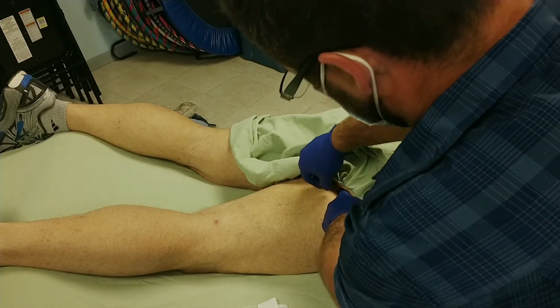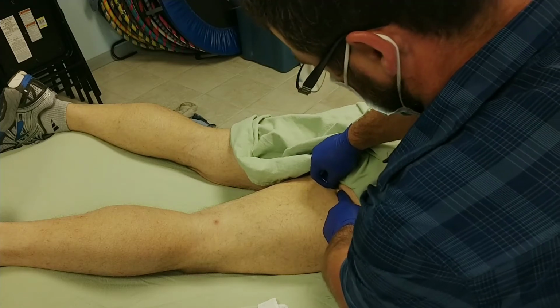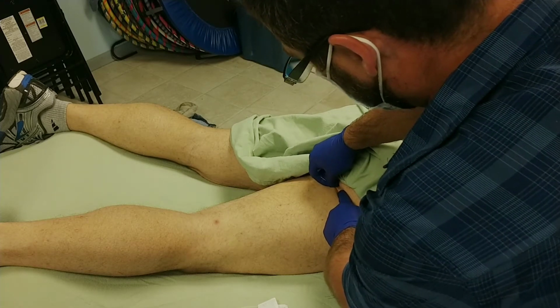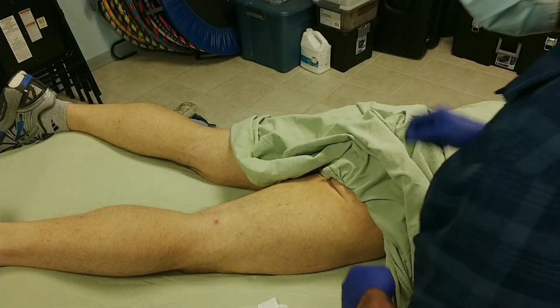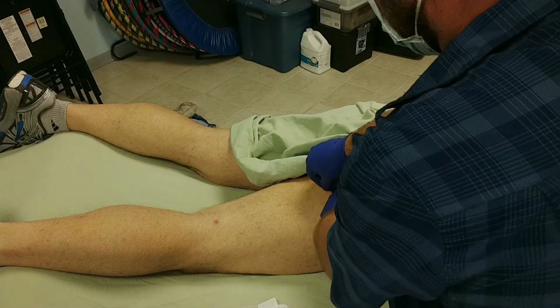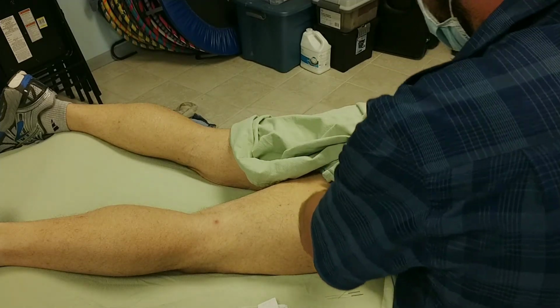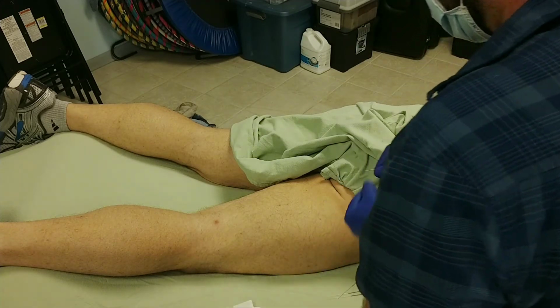I'll just come just below the ischial tuberosity and needle up towards it like this. That's okay too. It's very sticky feeling in tendinous material. So it'll feel like you're moving through something gummy and sticky. That's the combined tendon for the hamstrings.